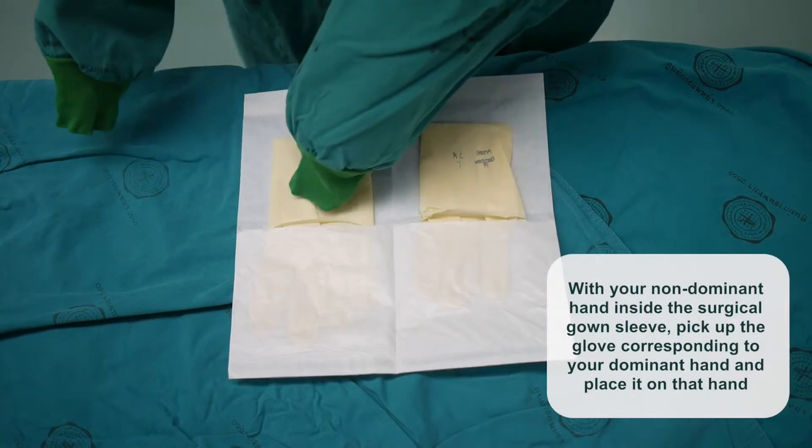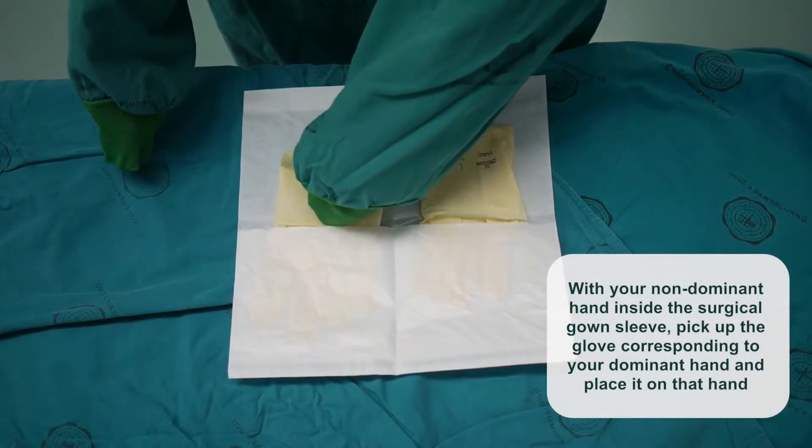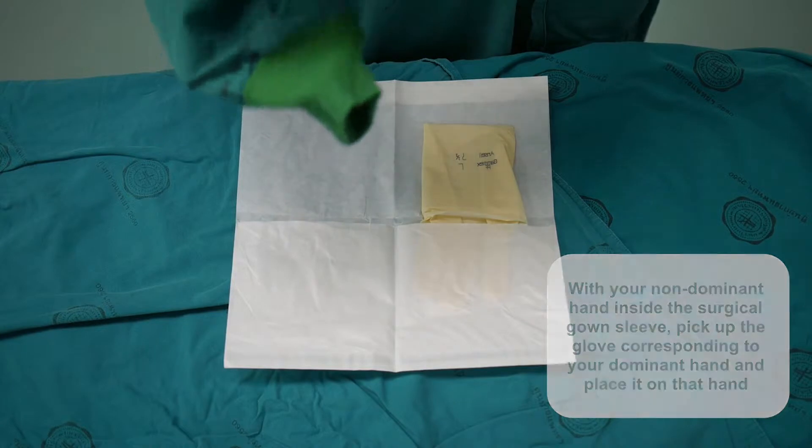Surgical Gloving. With your non-dominant hand inside the surgical gown sleeve, pick up the glove corresponding to your dominant hand and place it on that hand as shown.